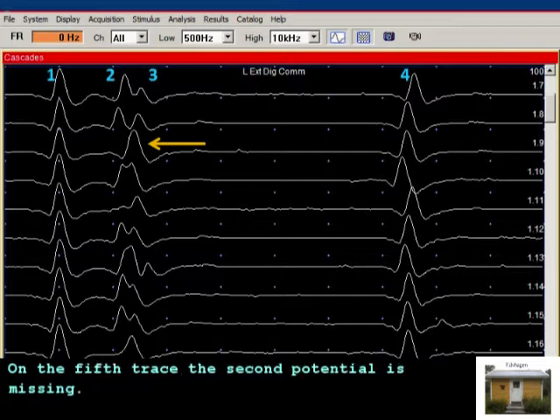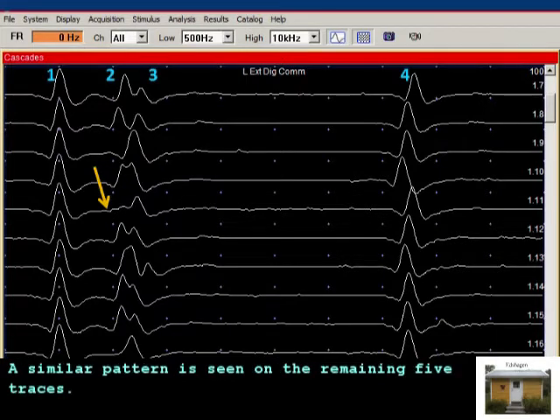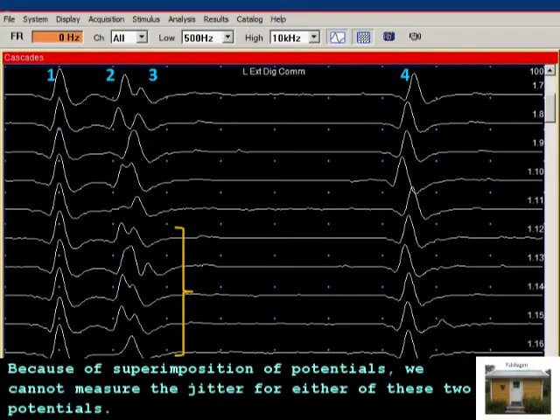On the fifth trace, the second potential is missing. This demonstrates increased jitter and blocking. A similar pattern is seen on the remaining five traces. Because of superimposition of potentials, we can't measure the jitter for either of these two potentials.